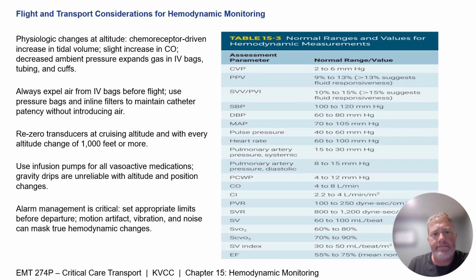And transport clinicians should be able to anticipate these problems before they leave and build redundancy into the plan through setting alarms appropriately, through frequent assessment, through ensuring that the line placement is accurate and secure, and that you've got backup methods of verification if at all possible.